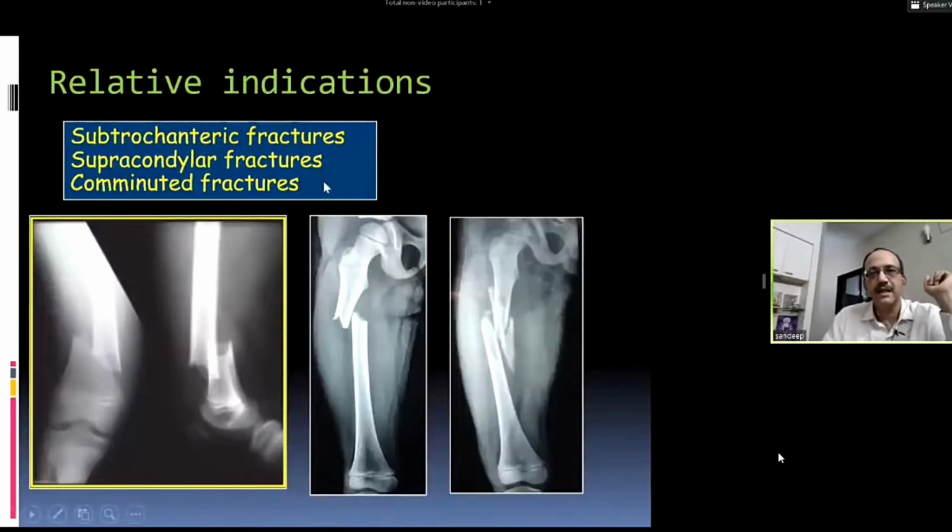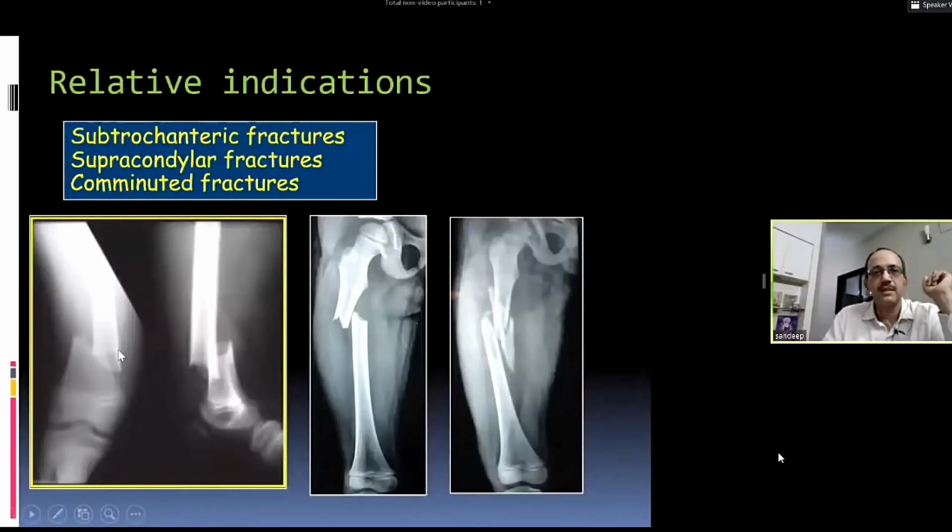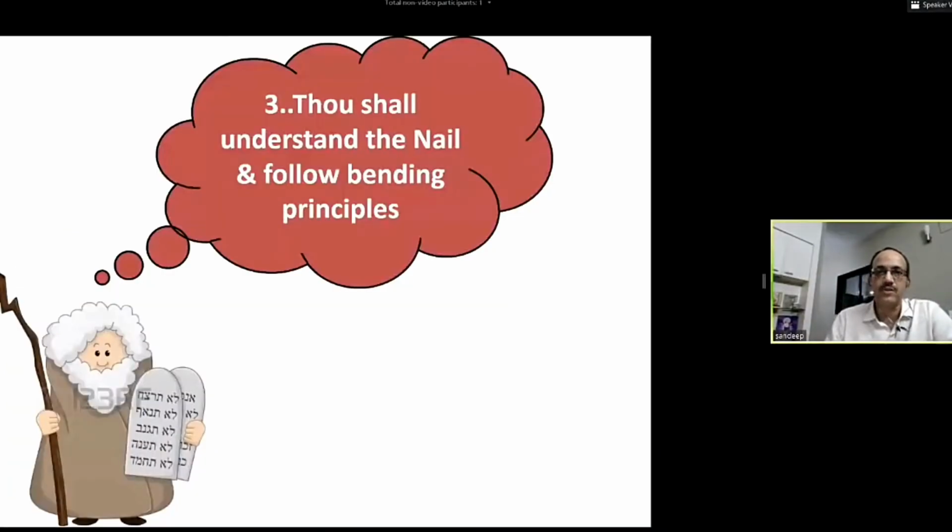And extended indications or relative indications are where you can use it in subtrochanteric or supracondylar fractures, but with a little modification of technique, which you will understand as you go along. Comminution actually is a contraindication, but we can bypass that by making some modifications, which I will talk about eventually.